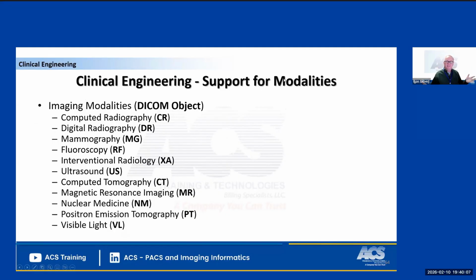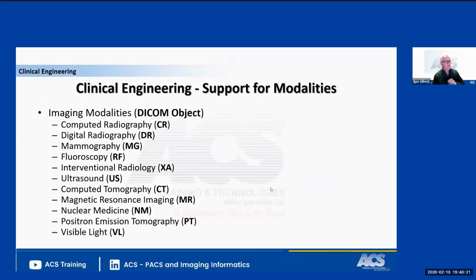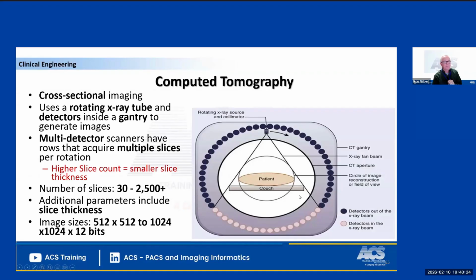So modalities, yes, are something you put a patient in, the human component. I am a technologist. I used to make images on patients, so I understand that part. But now we're looking at it from the PACS administrator's side, as all the data that we're moving through and what its purpose is. We're going to go into how the CT scanners are put together and how they work, and talk about some details, like what the gantry is that holds everything, what the tube is doing inside there. Because if you're an IT person, you probably don't know this, and the test will ask you certain questions about the modalities. Now, it's not going to be a lot of detail, but you at least will be able to carry a conversation or know what a technologist is trying to tell you.